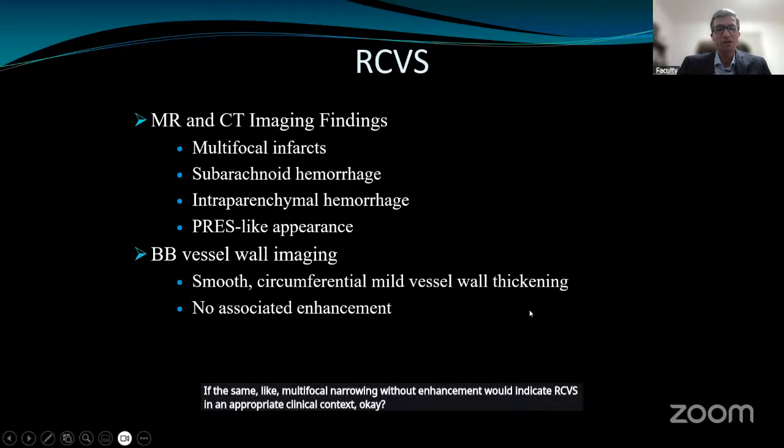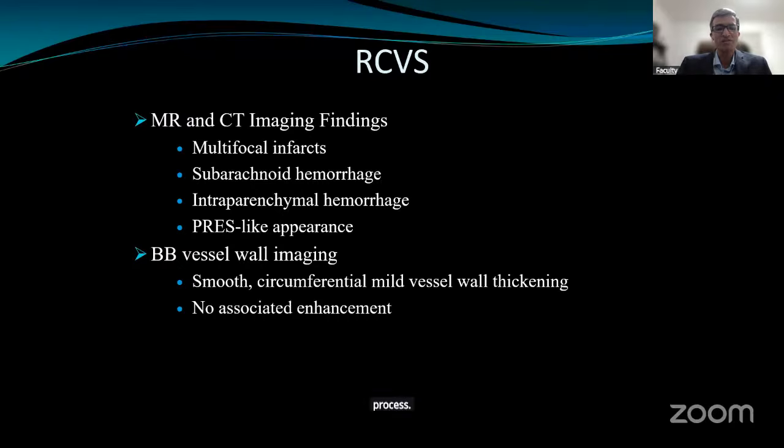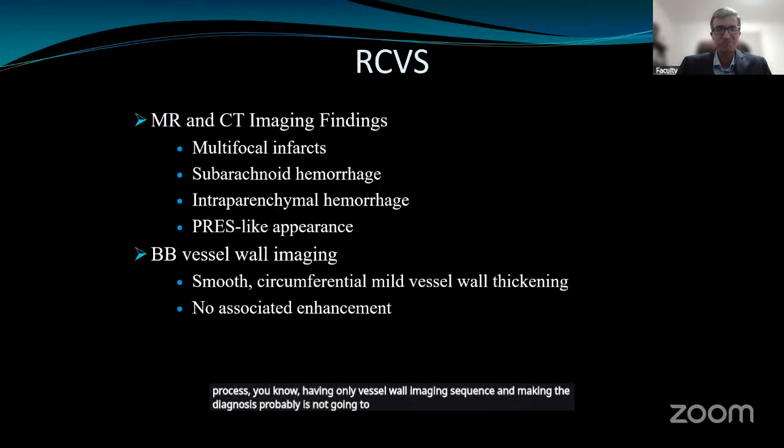So remember, vessel wall imaging is an adjunct to the existing imaging. It's not like you can use this as a standalone imaging process. Having only vessel wall imaging sequence and making the diagnosis probably is not going to be helpful for you.